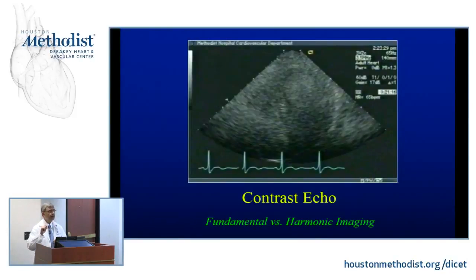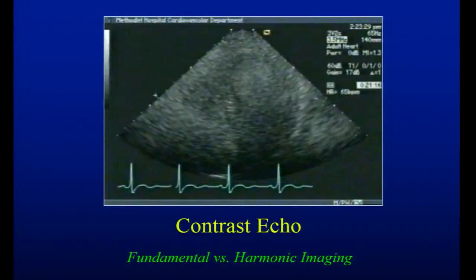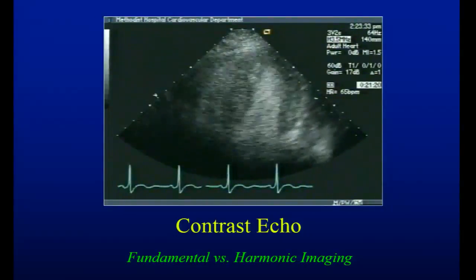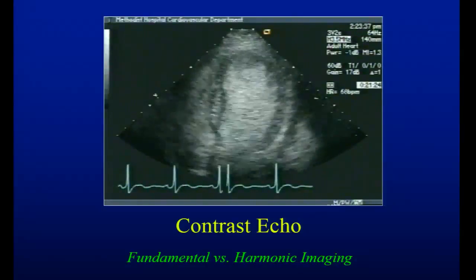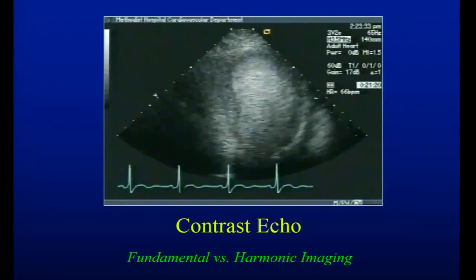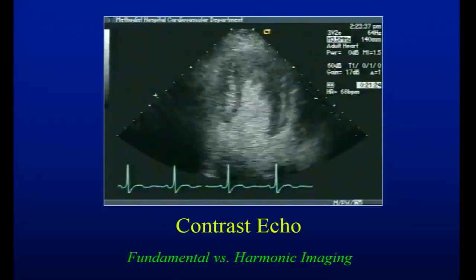See what happens to the image. This is the same patient within a fraction of a second difference. So take a look at that. This is fundamental imaging. It doesn't look the most appealing. And this is harmonic. And we're going to go back to fundamental, and this is harmonic. It's quite a difference, right?